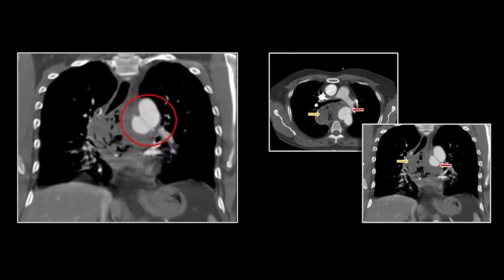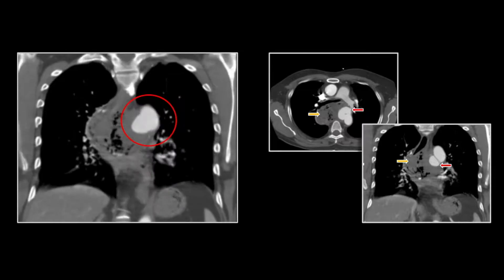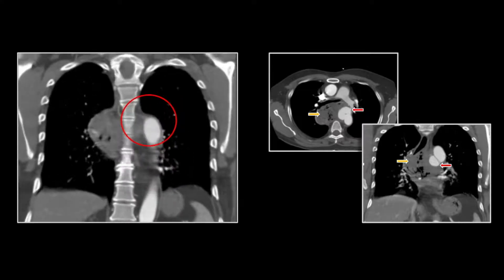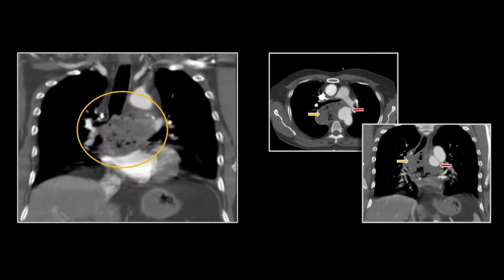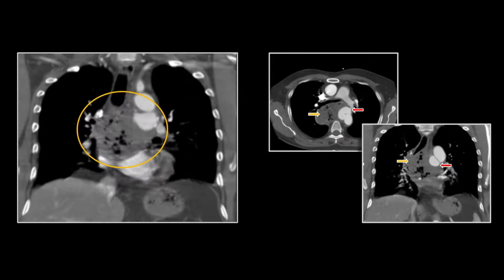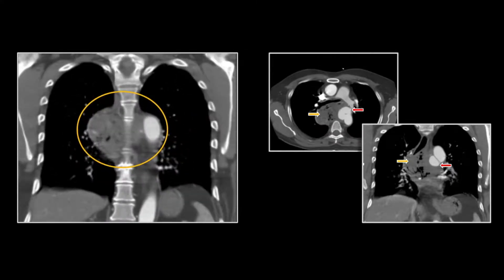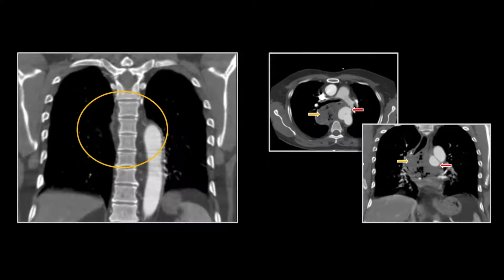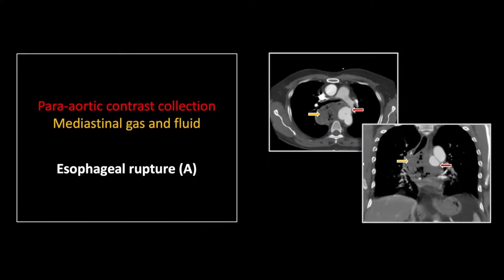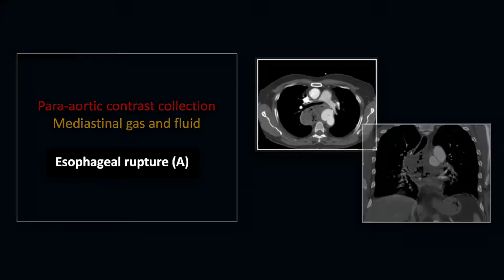There on the coronal is the pseudoaneurysm related to the aortic laceration, and a good view of the circumscribed collection of gas and fluid with the entrance and exit of the proximal and distal aspects of the esophagus. So that is an esophageal rupture with an associated aortic laceration.